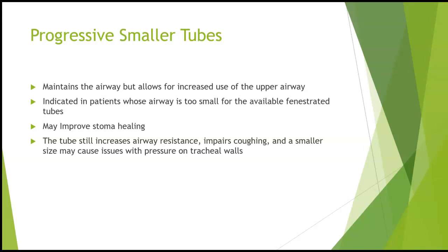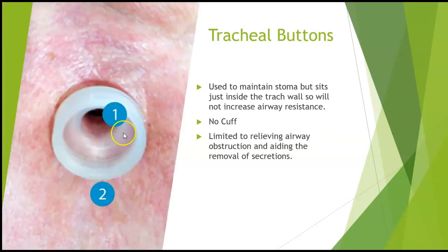But be aware that because I'm decreasing the diameter of these tubes, that's going to increase my airway resistance. That may impair my patient's ability to cough. And that smaller size may then not fit inside my airway appropriately and cause pressure on those tracheal walls.